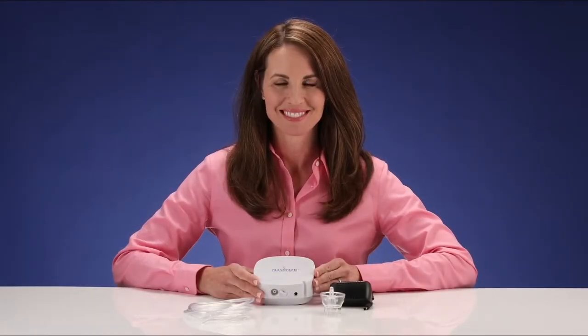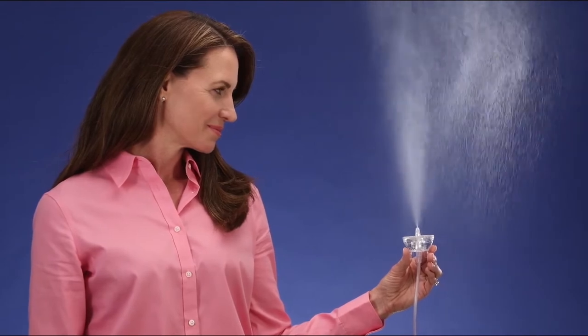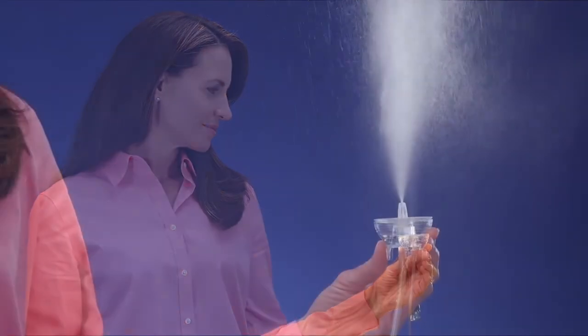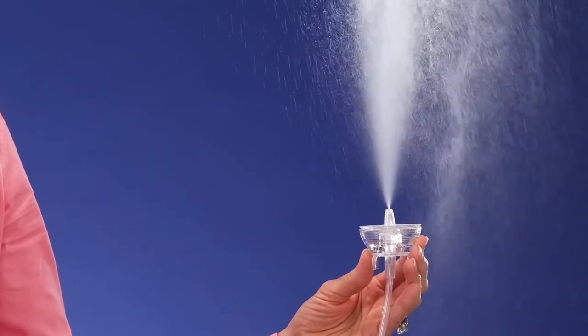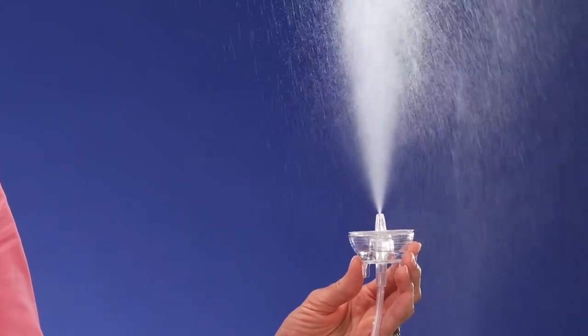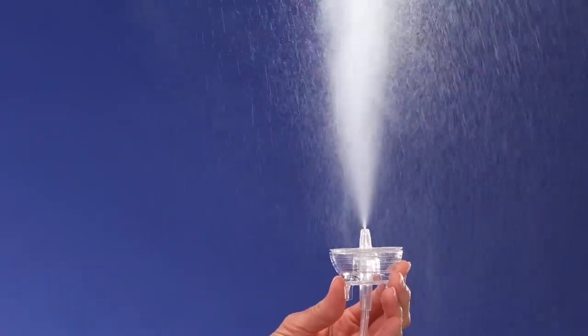Your Nasoneb System is specifically designed for irrigation and drug delivery to the nasal and paranasal sinus cavities. The Nasoneb System actively releases medications into the nasal cavity using a pressurized air stream, much like your ENT doctor may use to numb your nose prior to an exam.